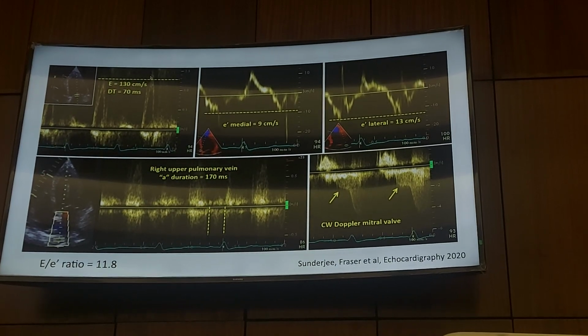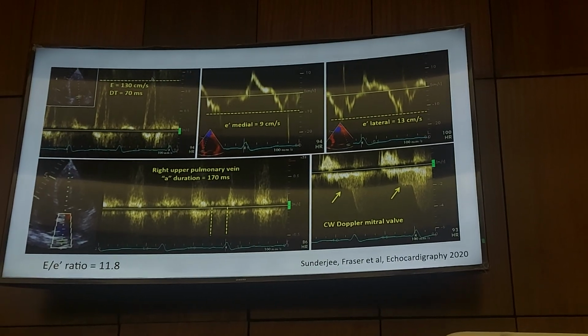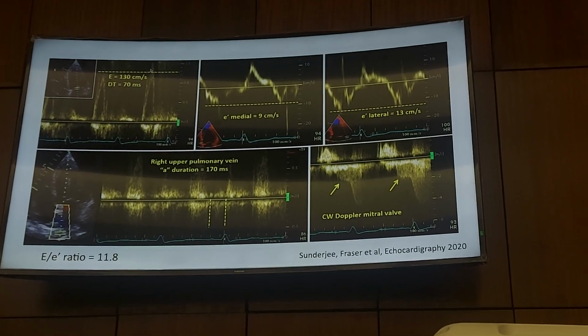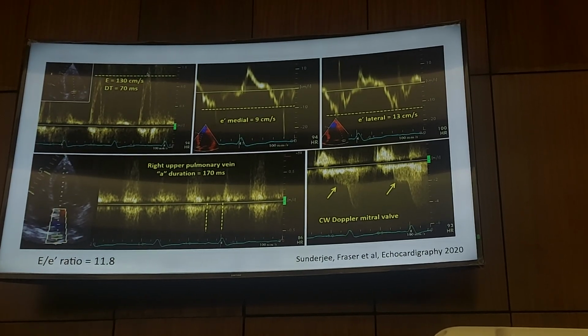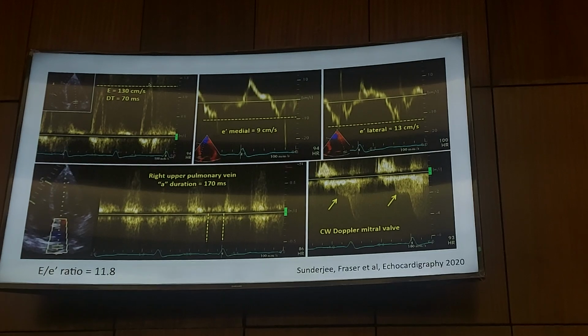You mentioned, sir, the pulmonary artery catheter. Actually, although we do VExUS all the time, we still use the pulmonary artery catheter. I don't think this is a substitute for the pulmonary artery catheter in complex patients. Not in complex patients, but if you have an E over E prime and you add a factor like 4, you can get the wedge pressure. Very good point. Can we go through this case together to answer your point?